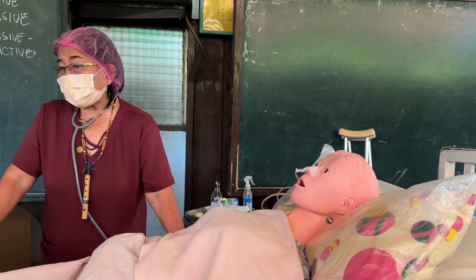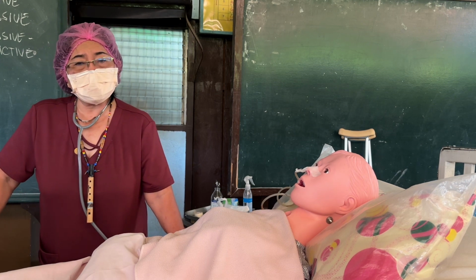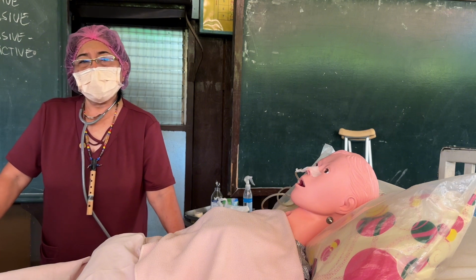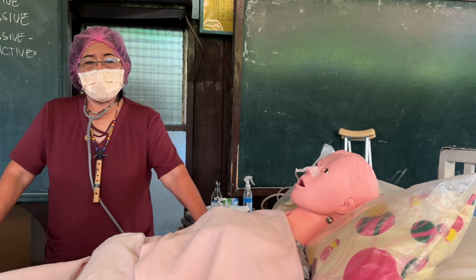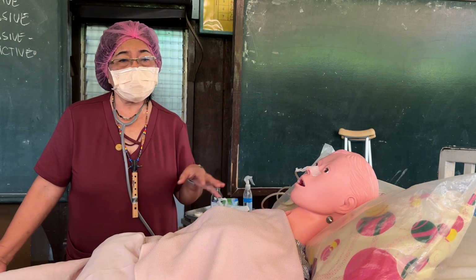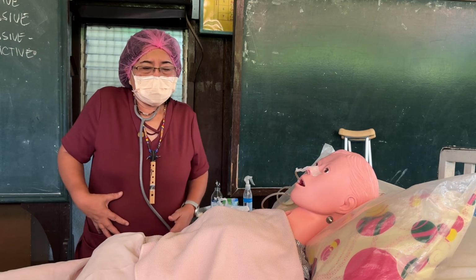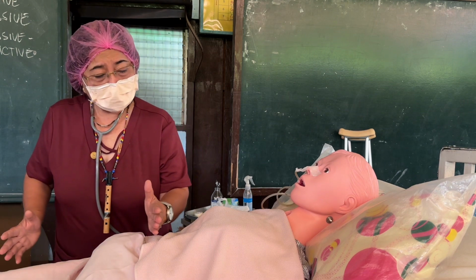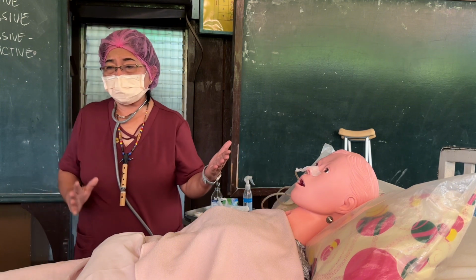So this is another case. This patient is very weak. He or she cannot feed by herself, and has no appetite. Now, we will do drainage. Why? The patient was admitted in the emergency room with a very enlarged abdomen. There is difficulty of breathing because of the enlargement of the abdomen, fully distended. The abdominal content is pressing up into the thoracic cavity, the lungs. So with difficulty of breathing, the patient should be in Fowler's position.